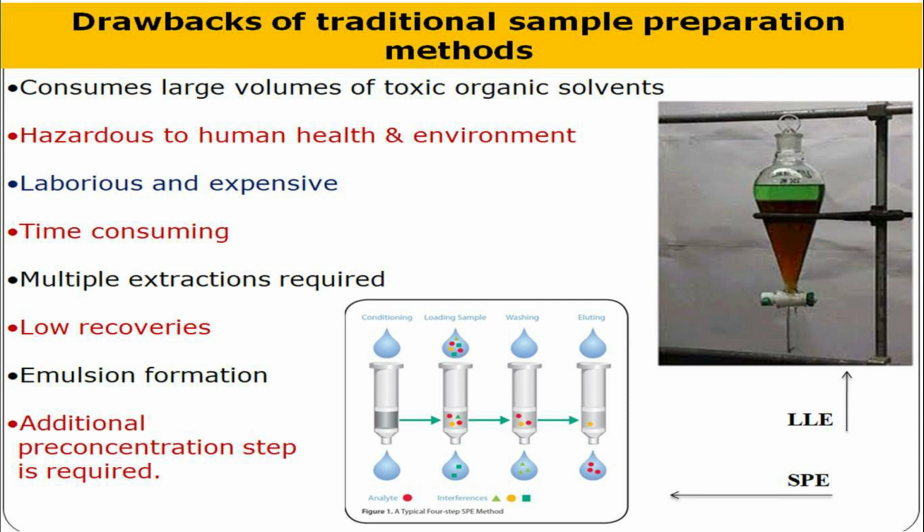Another factor is emulsion formation. We know that chloroform is an organic solvent, and when it is taken with biological samples, or the protein precipitate of the biological samples, which is in liquid form, they also contain a very large amount of lipid. Chloroform is lipophilic. It dissolves those lipids into itself, and then the formation of the emulsion takes place. So we have to break that emulsion. That is also time consuming, and it also consumes some reagents.